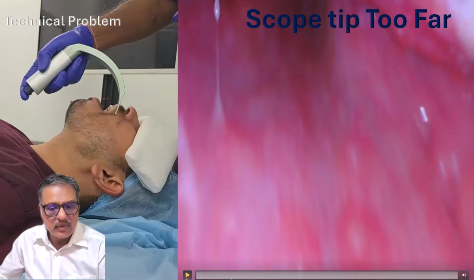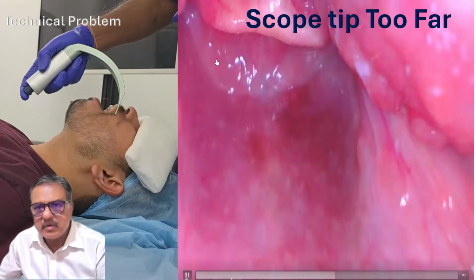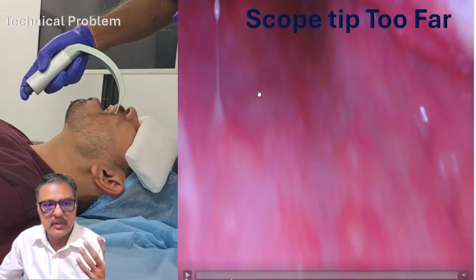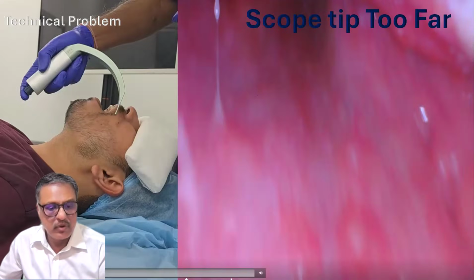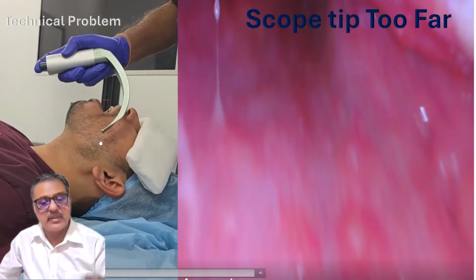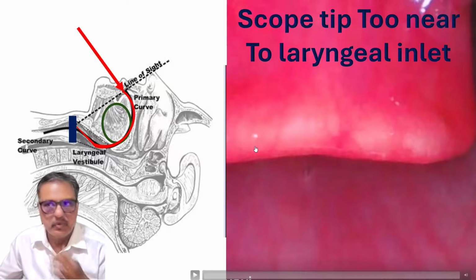Many times you are getting this type of view, where you are much away from the larynx. Why is it so? Because you have not inserted the blade to the proper depth. In such a case, advance the blade to a proper depth to get the proper laryngeal view.